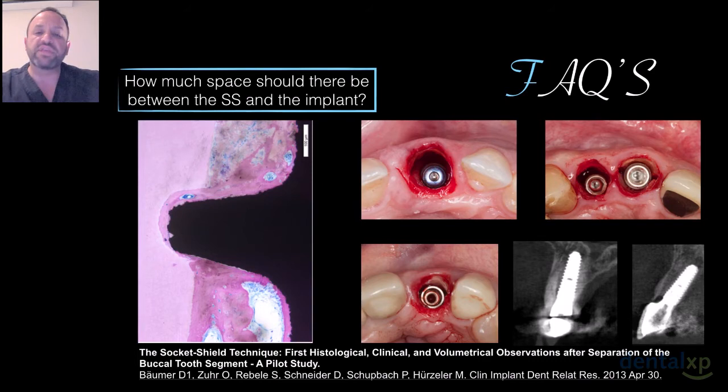The most important thing is that you don't want too much pressure that it's going to actually push it out or cause movement of that plate. And I think that's the critical issue here, is that you can lightly touch it, but do not cut into it, because cutting into it may mobilize it and loosen it. And remember, if you have a loose socket shield, it will cause an infection and destroy the bone.